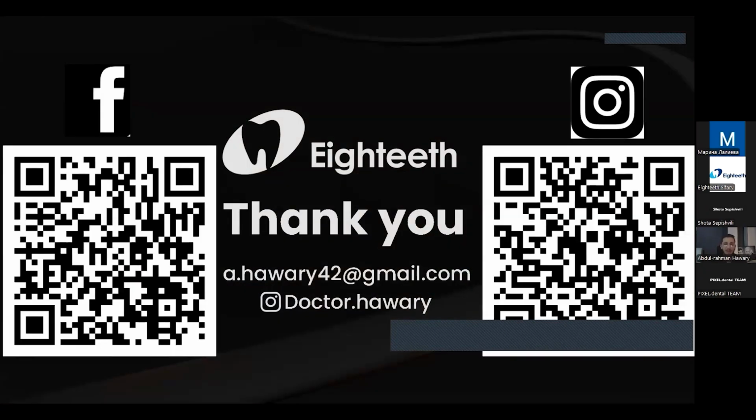We're just trying to introduce the new scanner, showcase how to perfectly use it, and some cases that we've actually done using it. So this is a quick session.